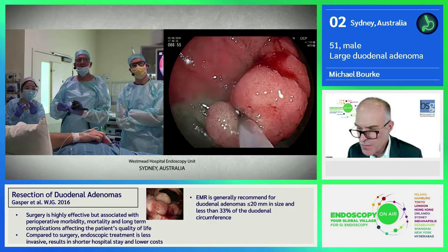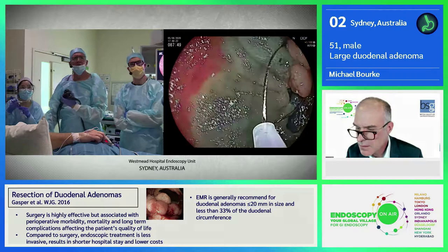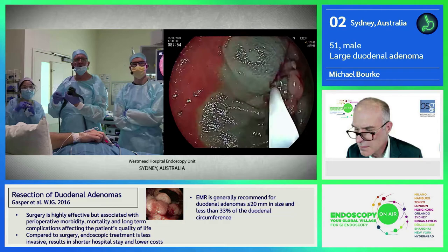Just for my interest, good. I think he had a positive FOBT and had a screening upper endoscopy. Yeah, he had iron deficiency anemia. Okay, yeah, commonly, yeah, close. Same with papillary adenomas. So good margin of normal tissue.